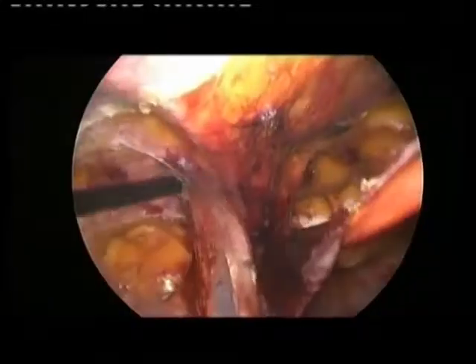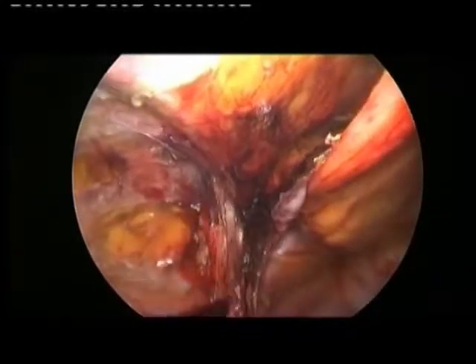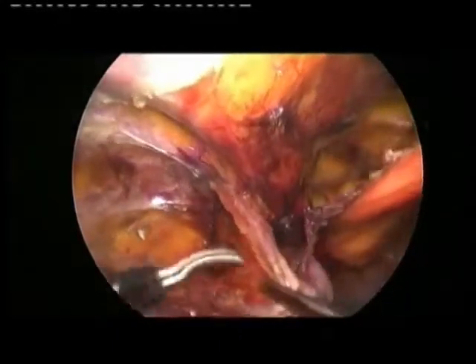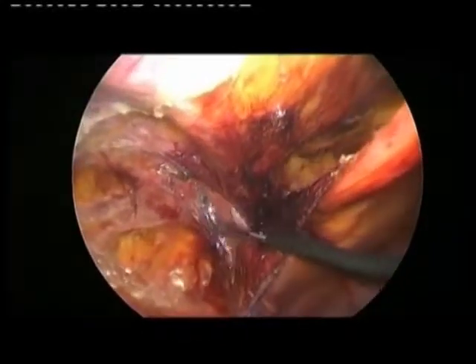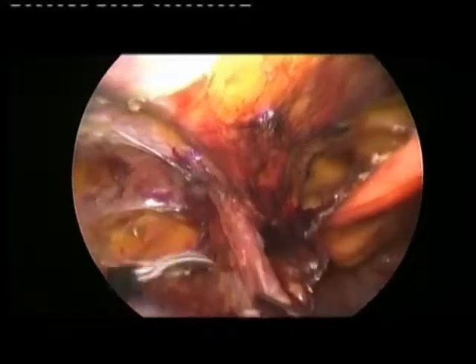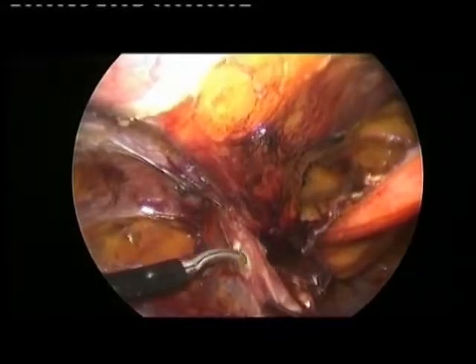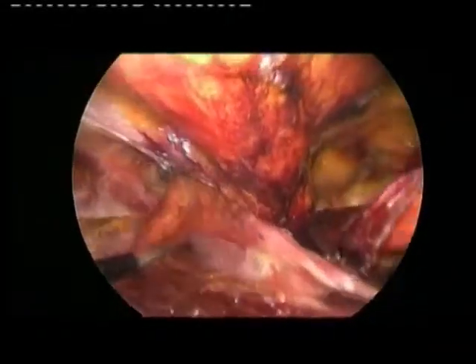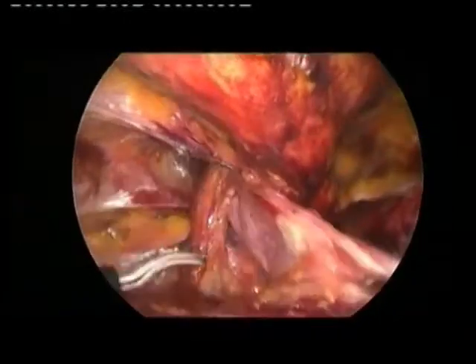How is the view in the room? Nice. Okay. This is the sac. Okay, this is the spermatic cord, okay? And this is the sac.